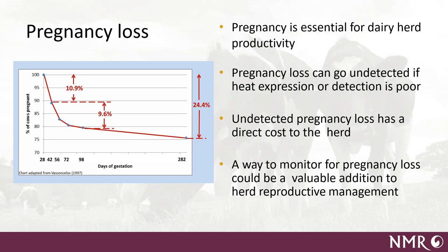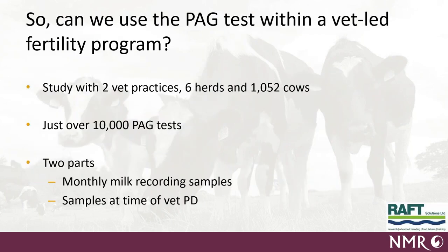So our question was around how can we use this PAG test? How can it be a valuable addition to a herd reproductive management program? And quite simply, our study question that we posed was, can we use this PAG test within a vet-led fertility program?